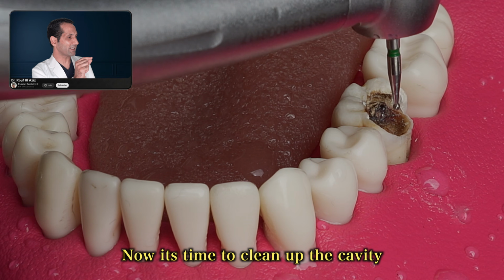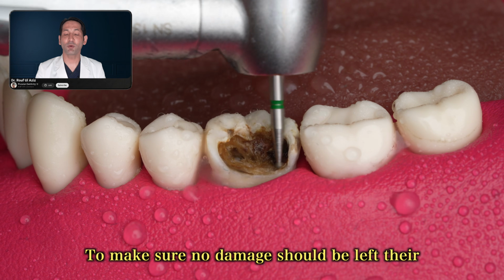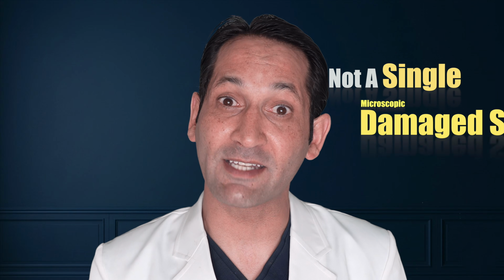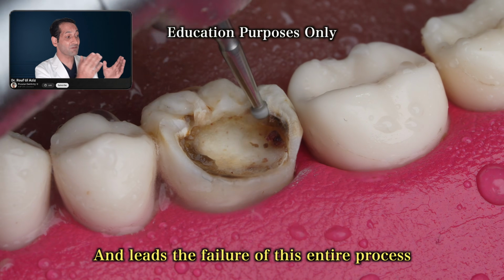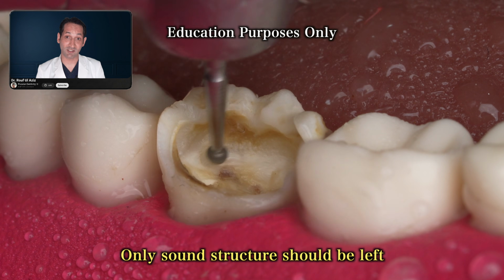Now it's time to clean up the cavity, the damage on the tooth, using high-speed drills to make sure no damage is left there. Not a single microscopic damaged spot. Otherwise the bacteria from the left spot starts growing again beneath the final restoration and leads to the failure of this entire process. So it's very important that all the damage is removed and only sound structure is left.